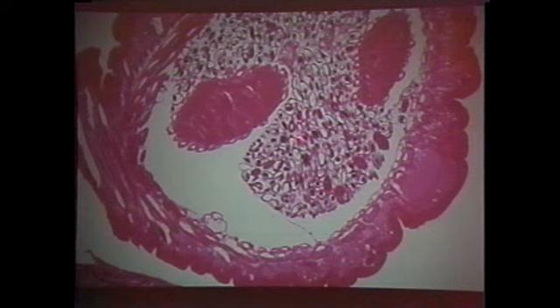So when you get just one cross-section of this little booger, and it has these lemnisci and these strange muscles, you're not going to diagnose it as a Physaloptera. Huh? And it happens, people. But now you know different. Here's another acanthocephalan. Look, the muscles are different. They're in different layers. And the eggs are much different than what we've seen in nematodes as well.